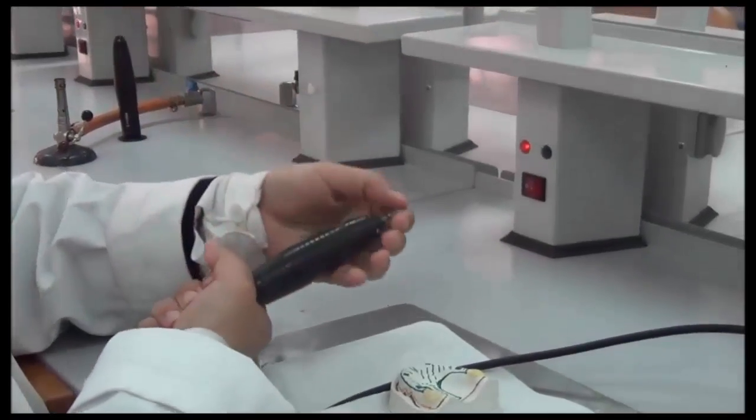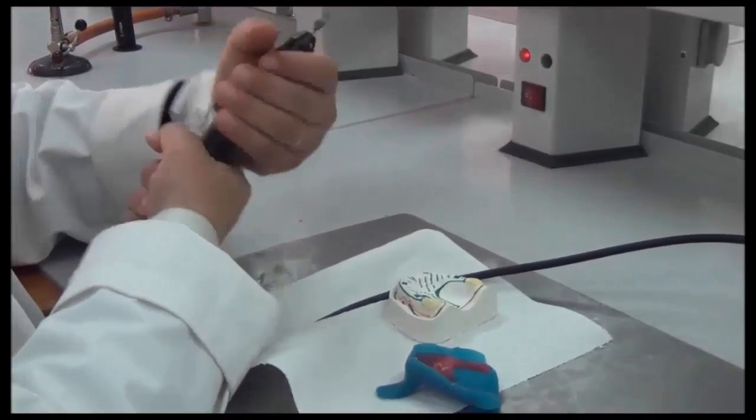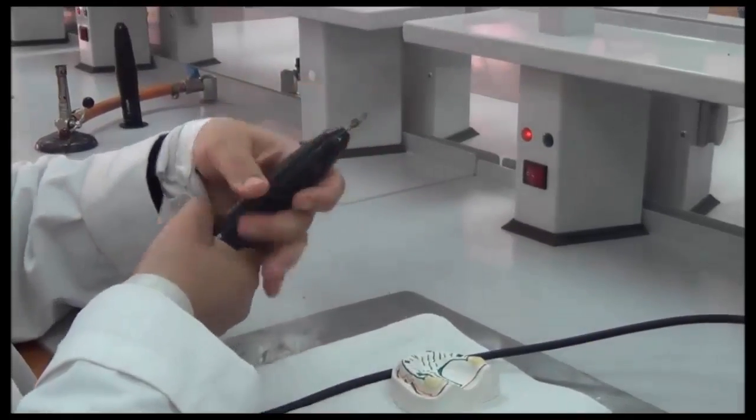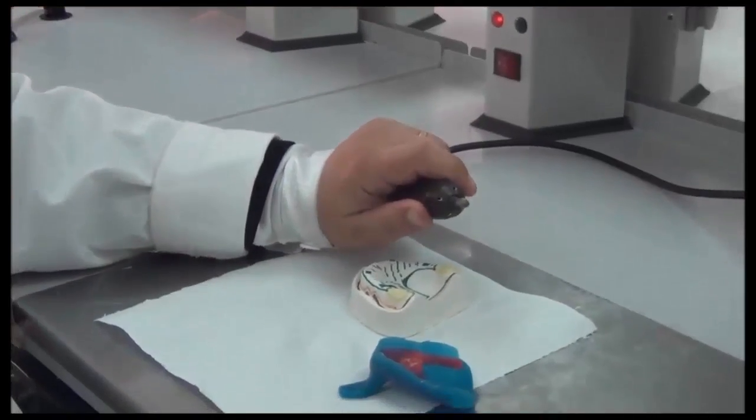To take the burr in and out, you need to rotate the handpiece, put your acrylic burr in, and then secure it. We need to make sure that burrs are secure before working, because if they are not secure, they might come out and traumatize you.